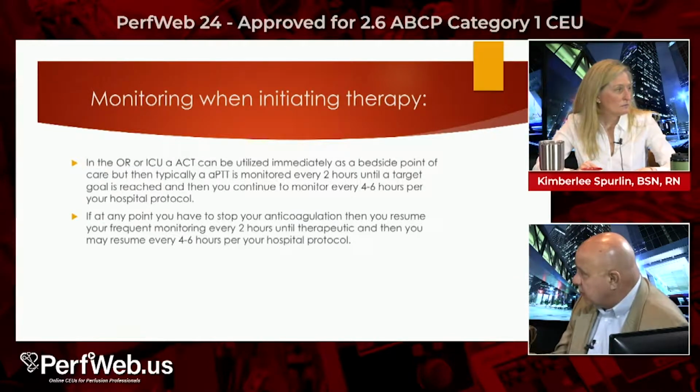I drew a sample, did it again. And it's not like it sits there and is degrading, because the ACT went up versus down. So I guess I don't have a lot of confidence in ACTs when we're in the low range.